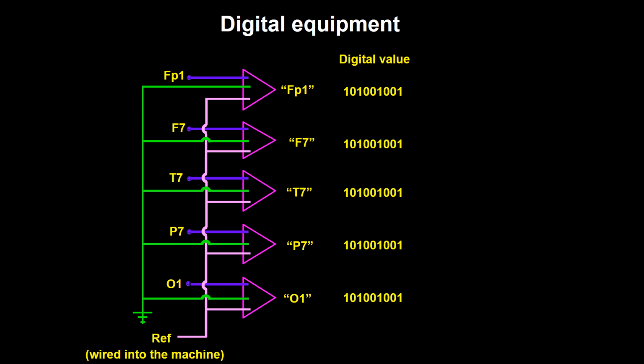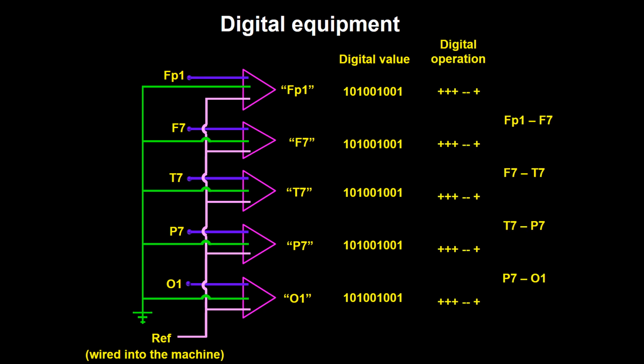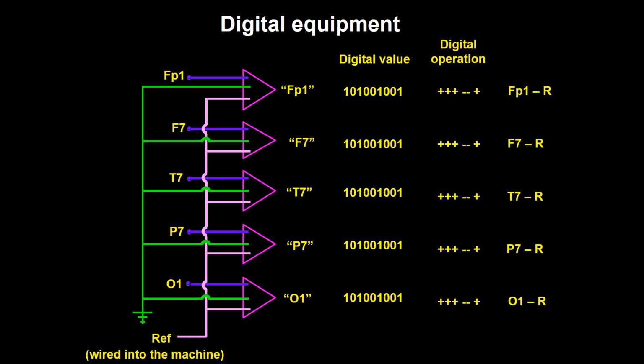The processing will start by giving it a value using the binary numerical system. That binary numerical system is later manipulated and ultimately displayed, in this case as a bipolar recording, or as a referential montage using whatever reference is desired by the reader.